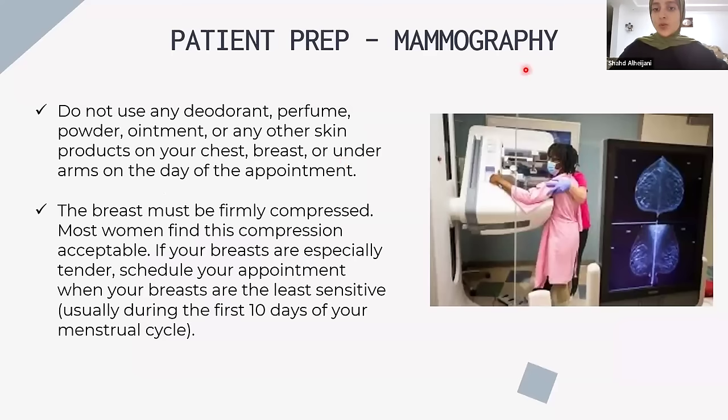Now moving on to mammography. Mammography is basically a screening tool to check the breast tissue. Now, you ask the patient not to use any deodorants, perfume, powder, or ointment on the day of the appointment. And as you can see here in this diagram, the breast will be firmly compressed during the exam. Usually it's acceptable, but for some patients it will be painful, especially if the breasts are tender. So schedule the appointment when the breasts are least sensitive.